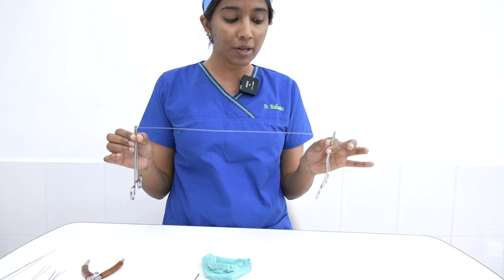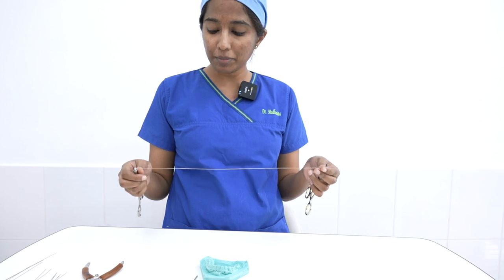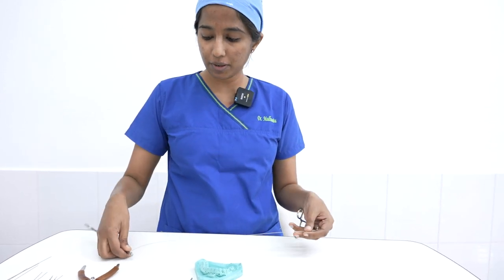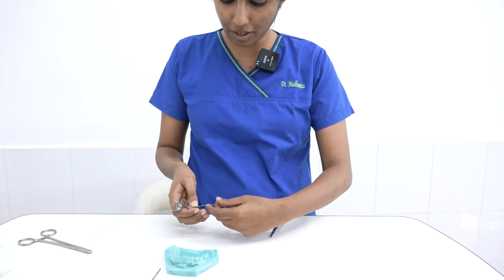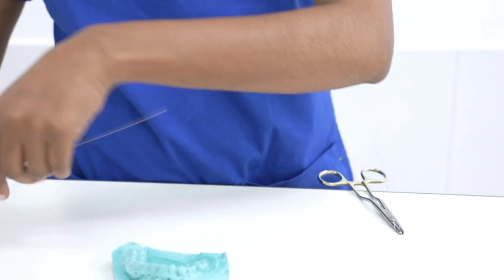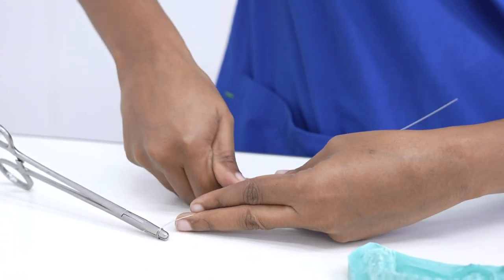Mind you, I say 10 percent because if you over-stretch this wire it leads to a concept called work hardening, which makes the wire brittle. Once you place the eyelets, I am now going to cut it into two equal sizes.